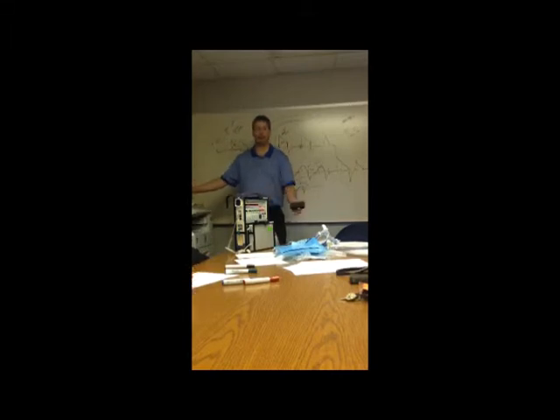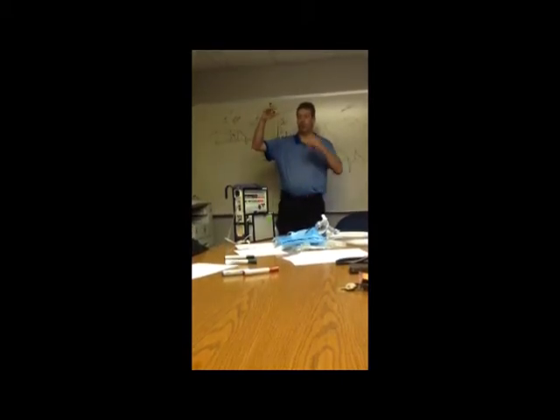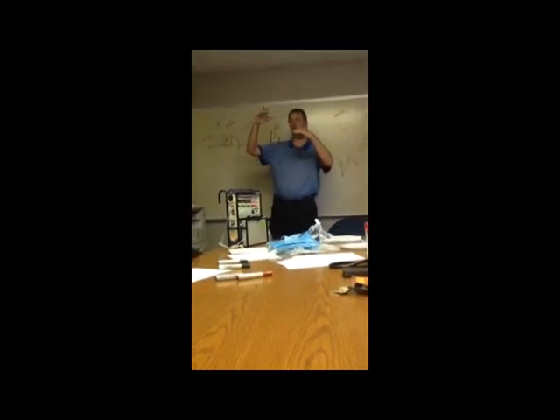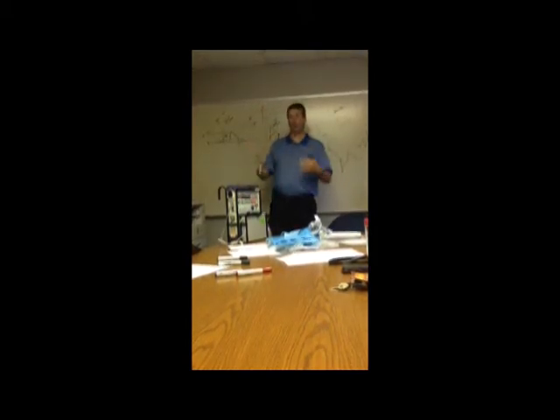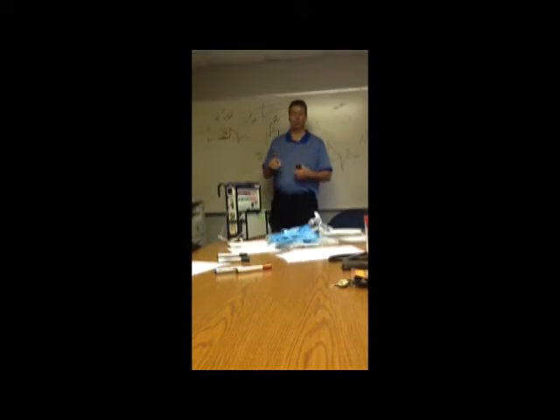I wouldn't expect you to bring somebody in and say, well, he's on 80%, so I went up to 12.5 a PEEP. Problem with that is you've got a max pressure on BiPAP you can use before you start blowing air into their stomach. So the higher you go up on that low number, the less room you have left to assist their inspiratory effort, okay? So I don't go up in a transport situation.